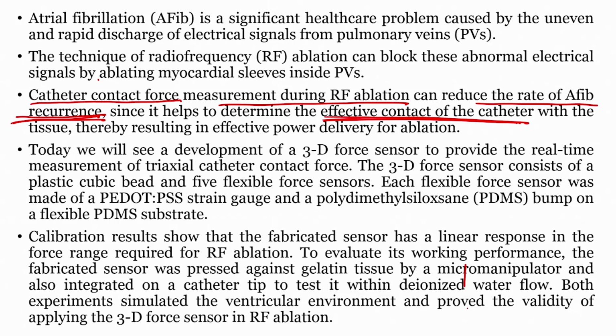Now, for that we will see the development of a 3D force sensor that we have worked on in a laboratory, to provide real time measurement of a triaxial catheter force sensor. The 3D force sensor consists of a plastic cube bead and 5 flexible force sensors.